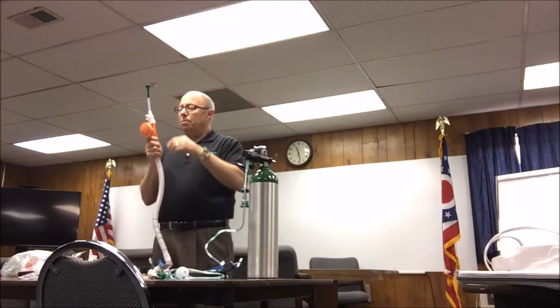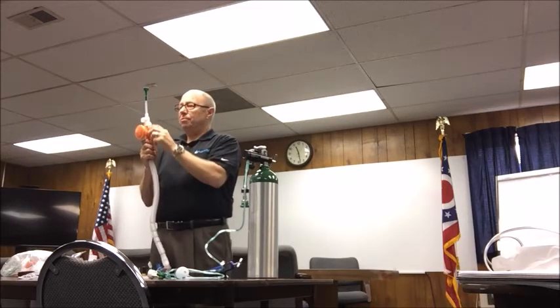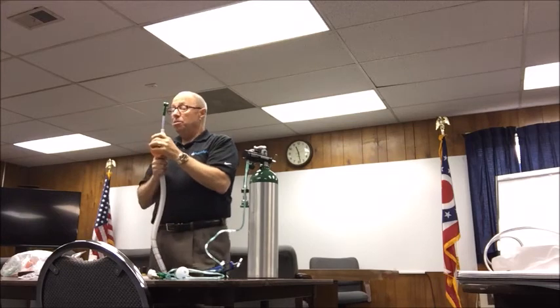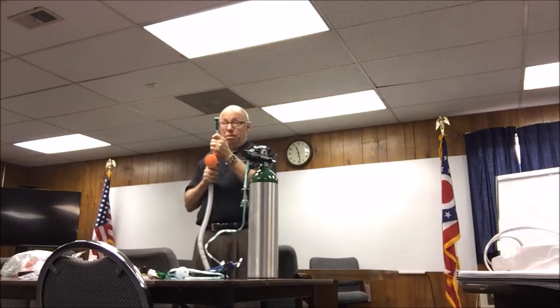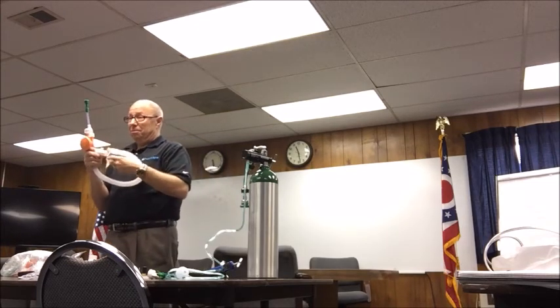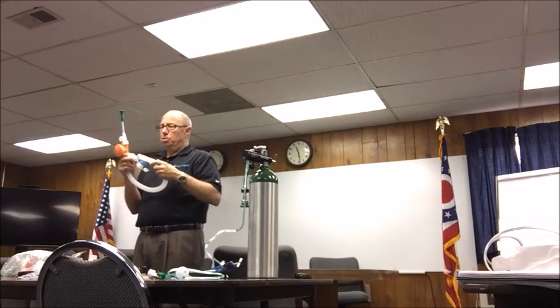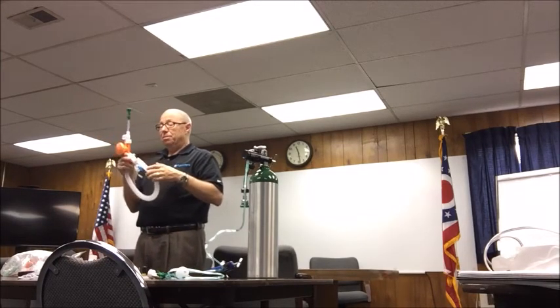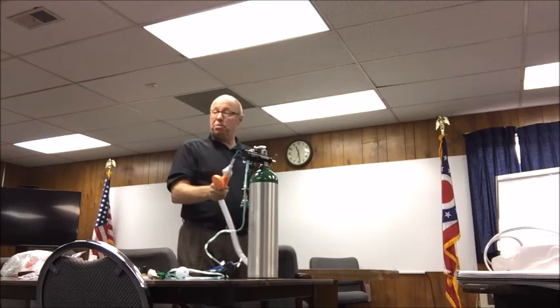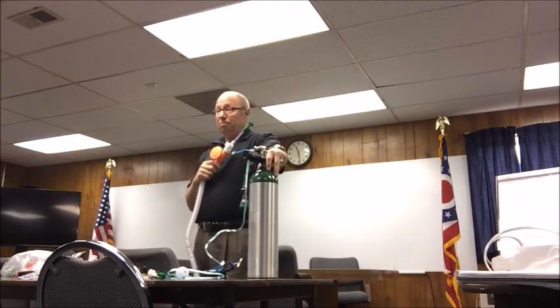Now, I can go from 30% to 60% to 90% FiO2. It's my understanding that these will be separate in the truck, because if you buy it like this, quite honestly, it's very expensive. You're not going to use them that much, I wouldn't think, but you'll have the ability to increase that. Now, I will tell you, at 90% on a full D tank, you'll blow through it in about 8 minutes.